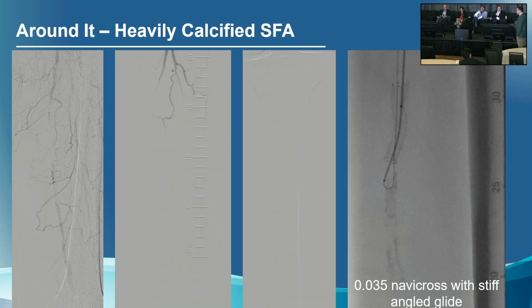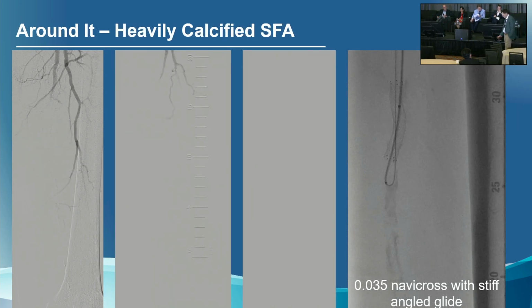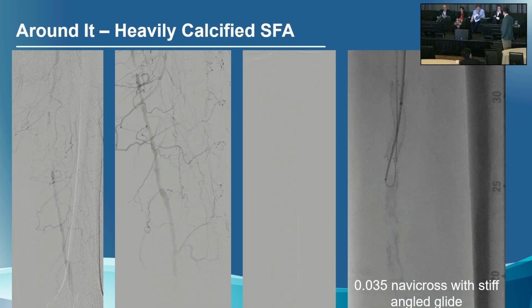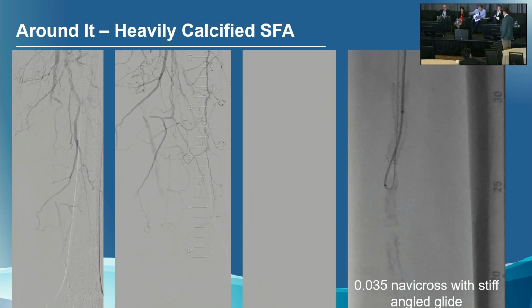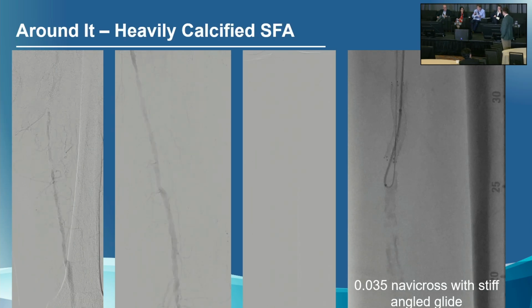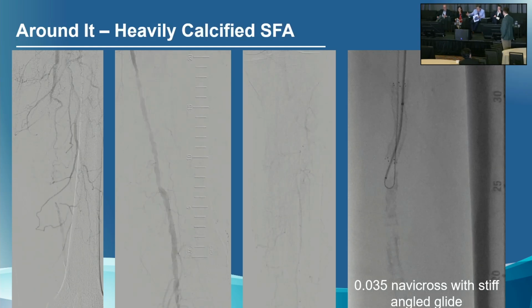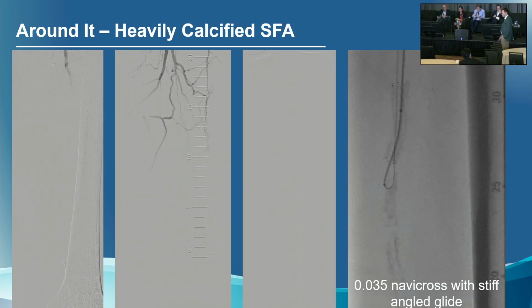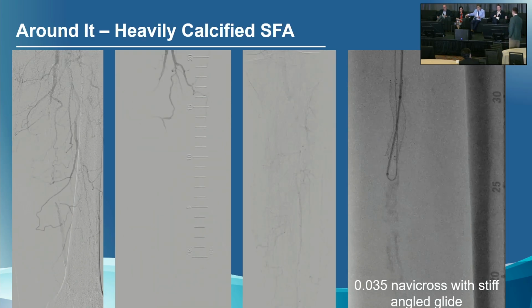I don't know that. If you don't have the angiograms, you can at least ask the patient, and when they say, I never felt one bit better the day I left, in fact, I was worse, then somebody may have stented right into a subintimal plane. By the way, we got one in Columbus referred to me last week, and I look and think, come on, man, that's out in the subintima. And that'd be another cause to at least look at. I don't know that. It was done years ago at an outside state.